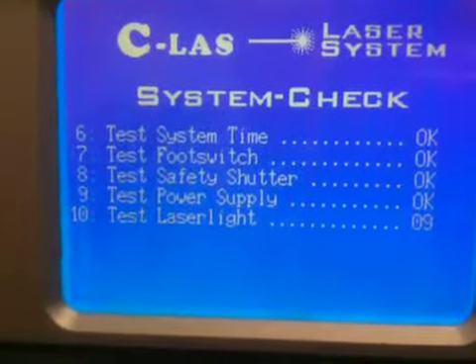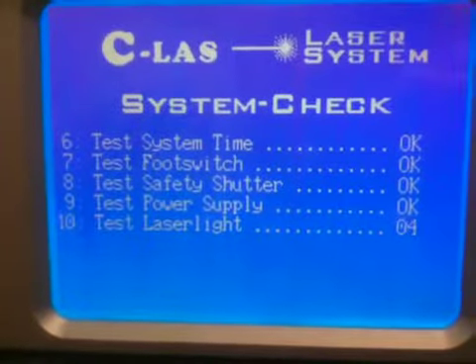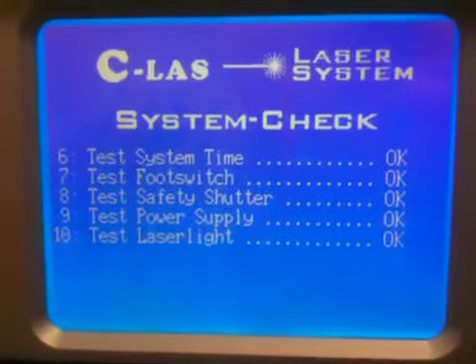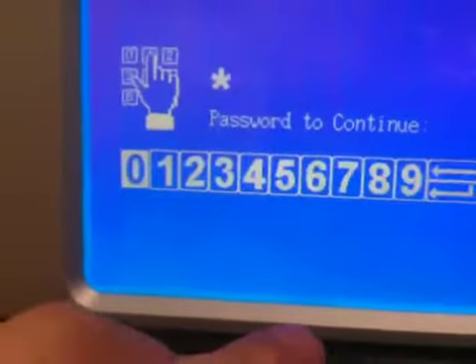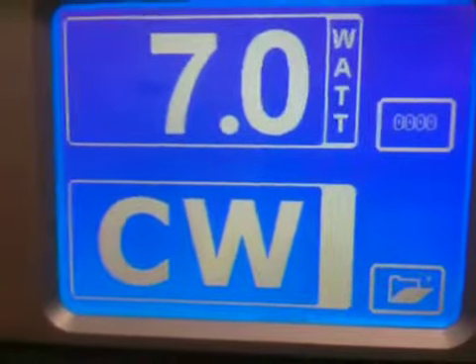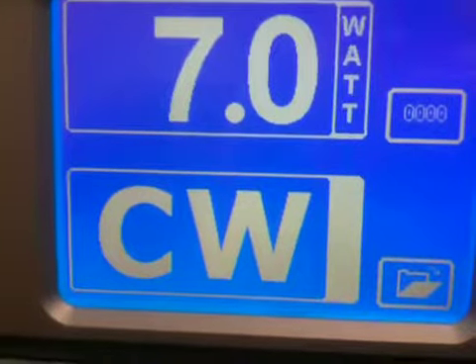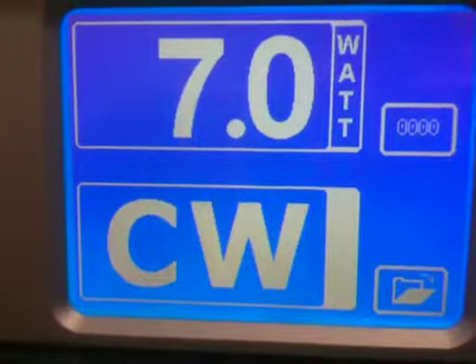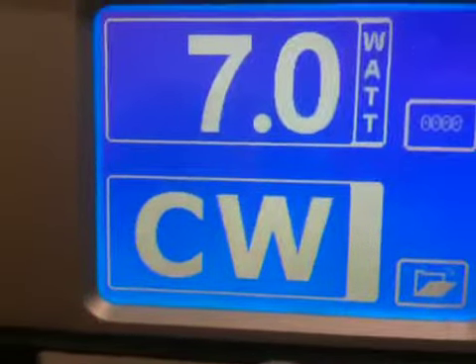So what you have on version 1.6 is very good, but as you would see here on version 1.7, it's very unpredictable. We can't figure out exactly what happens every single time. So now I do the same thing again. I enter the password, and now I'm at 7 watts CW. I remember before I ended up at 7 watts, 20 hertz, and now it went to 7 watts CW.